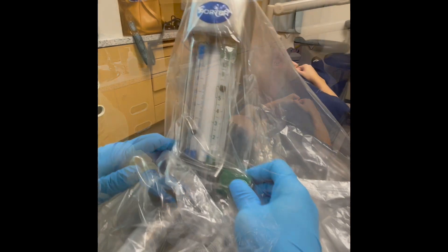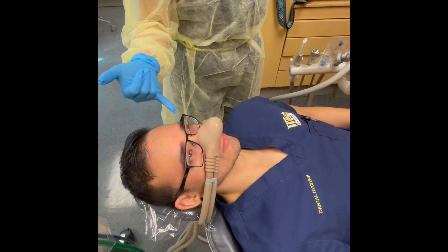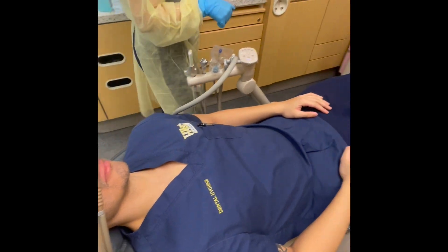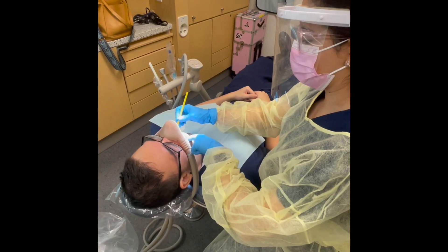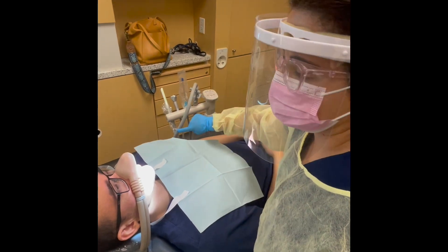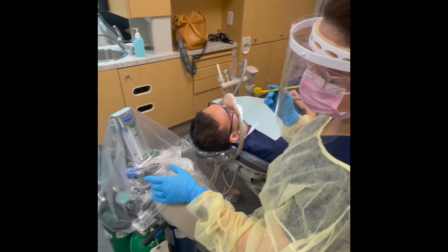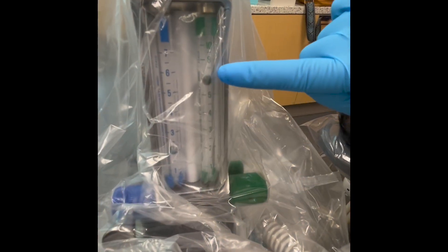Observe your patient after each titration. My patient required 3 titrations before he stated he was feeling relaxed. His eyes are glossy, eye movement is reduced, and sometimes there will be a slight smile. His hands and feet are relaxed as well. Make sure you are also looking for signs of over-sedation. Ask your patient if they are comfortable enough to begin the treatment and remind them to breathe through their nose. During your treatment, keep an eye on the equipment — make sure there are no kinks in the hoses and that the reservoir bag is not over-inflated or collapsed.